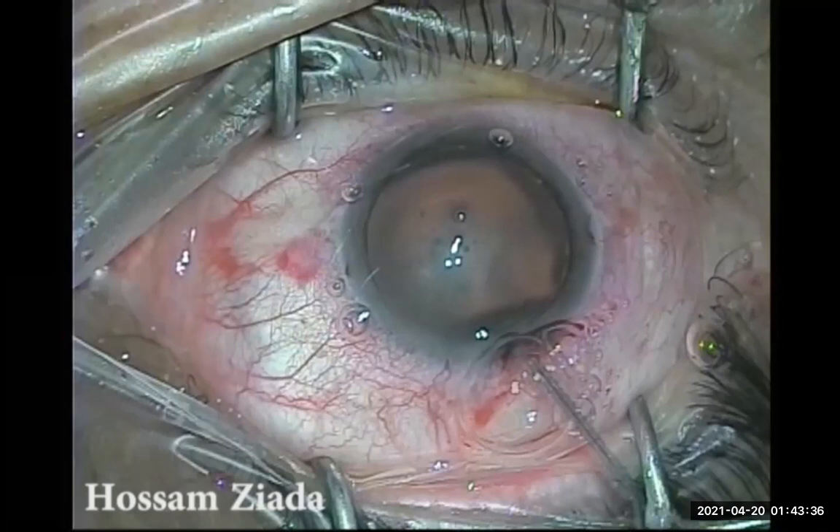The patient could see hand motion, much better than at presentation. The next step was preparation for surgery. The tension was much lower, but the pupil was still dilated, the lens still swollen, and vision still very limited. I prepared the patient for the second day and sent him to the OR, and before going to the OR I gave him Mannitol again to further decrease the intraocular pressure by reducing the vitreous pressure and volume.